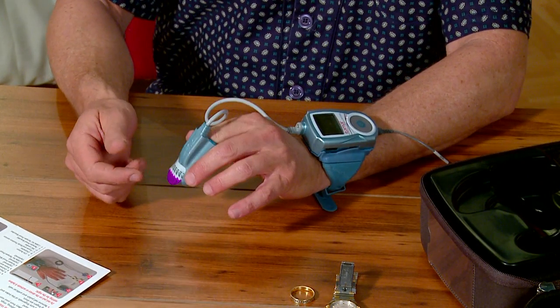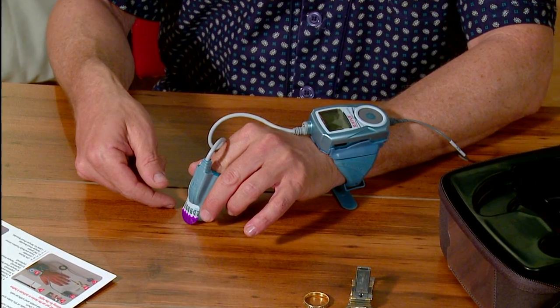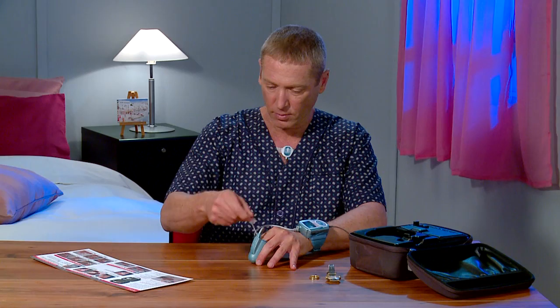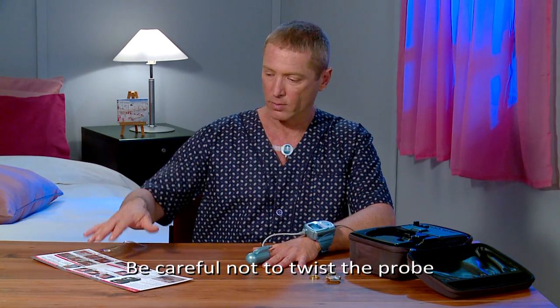The tab labeled 'top' should be situated on the top side of your finger. While pushing against a surface like a table or your leg, gently and firmly remove the tab. Be careful not to twist the probe.